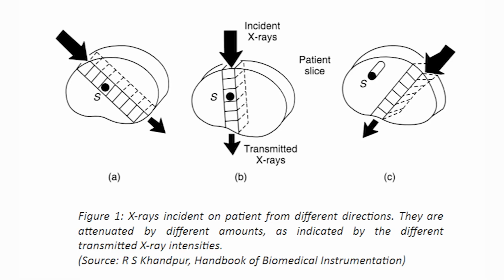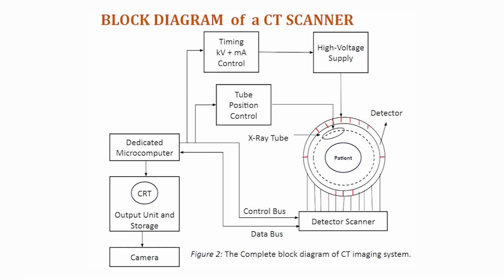Now, next I am going to explain the basic technique and block diagram of a CT machine. Figure 2 shows the complete block diagram of the CT imaging system.